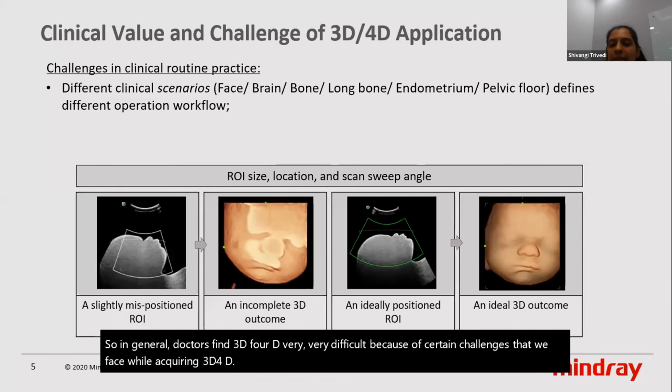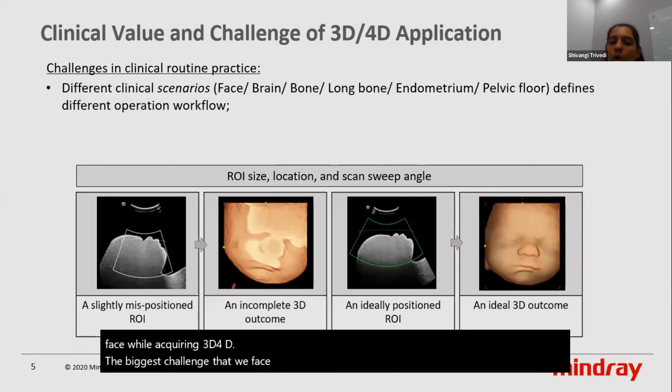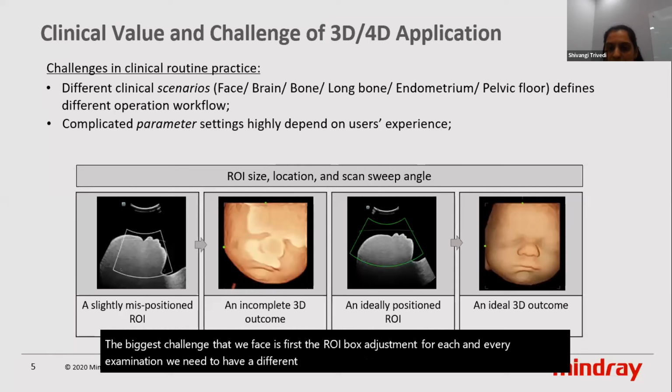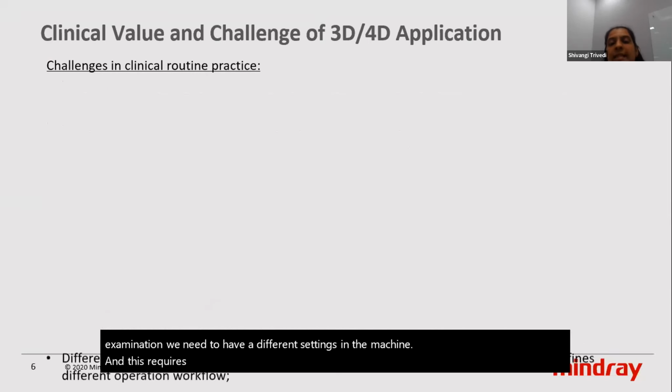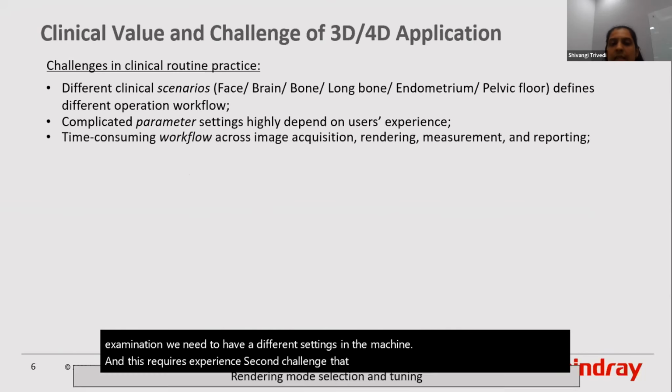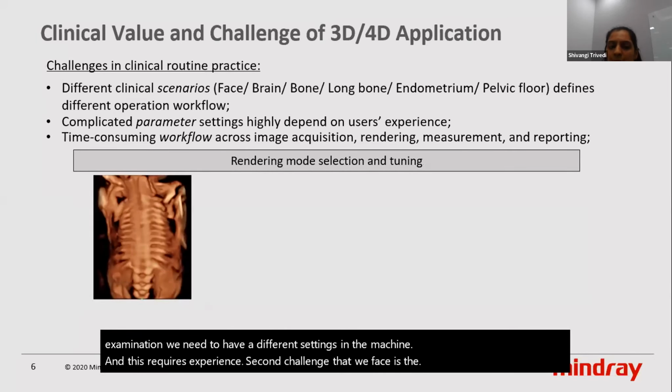The biggest challenge is the ROI box adjustment. For each and every examination, we need different settings in the machine, and this requires experience.